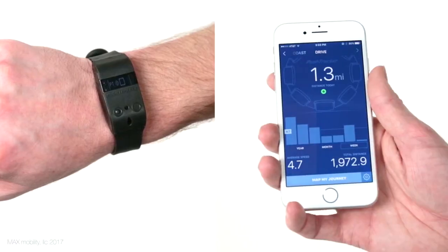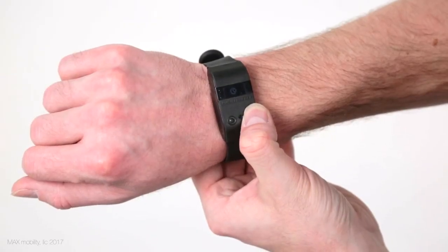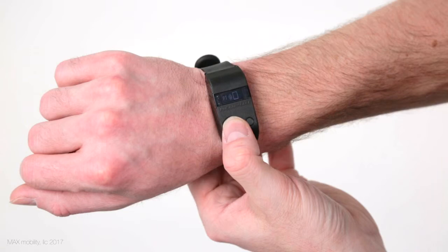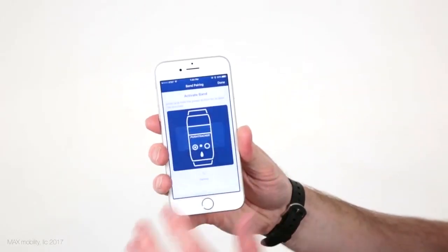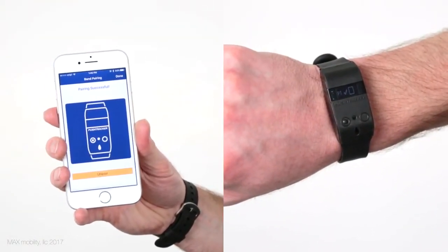But in order to use the app with your PushTracker and SmartDrive, you will first have to do initial Bluetooth pairing of the PushTracker with the device running the app. To do this, make sure Bluetooth is on and the app is open on your device, then scroll to and select the PT Bluetooth app pairing screen on your PushTracker wristband. You'll need to accept the pairing request on the app, at which point your PushTracker will show that you have successfully paired the 2 devices.